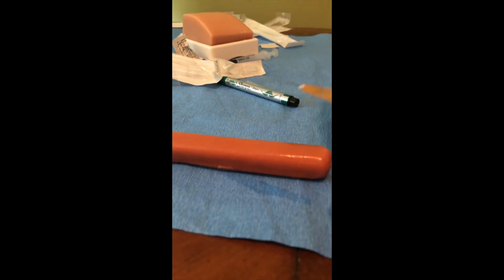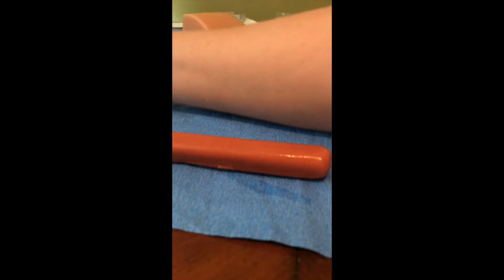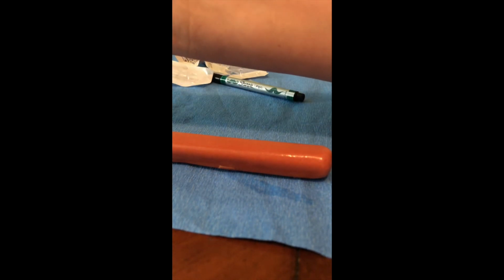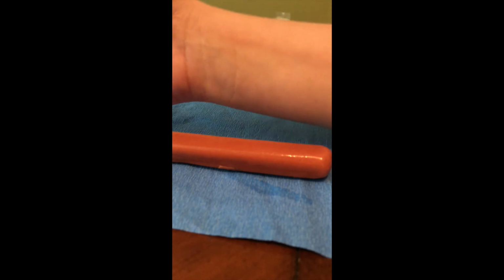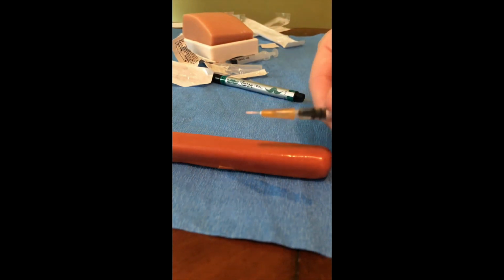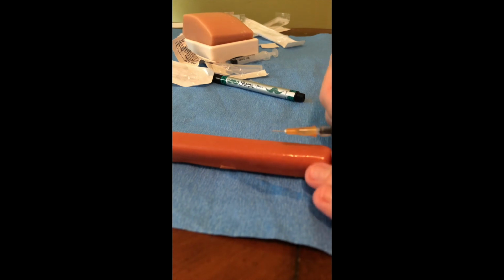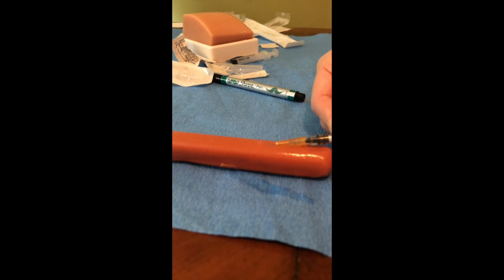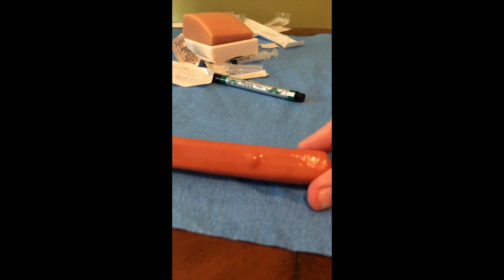And what we got to do is create a wheel. So when we're having a TB skin test, it's done on the forearm. Usually 3 to 4 finger lengths past the bend in your elbow. It's hard to show you. I can't see more. But we're going to go at it almost parallel with the skin. And all we're really going to do is cover the bevel. And you can see that wheel forming, and that's what we want. A nice bubble.